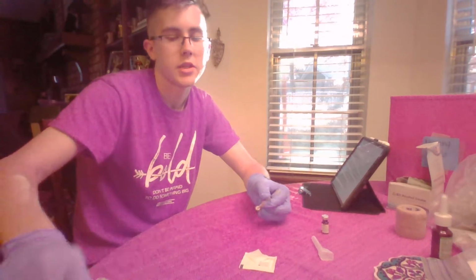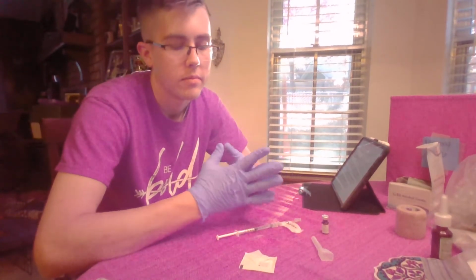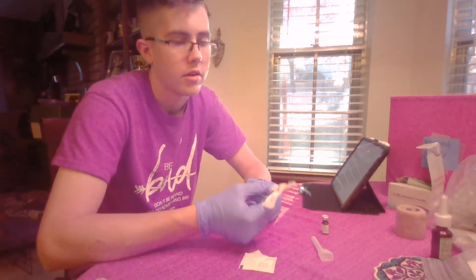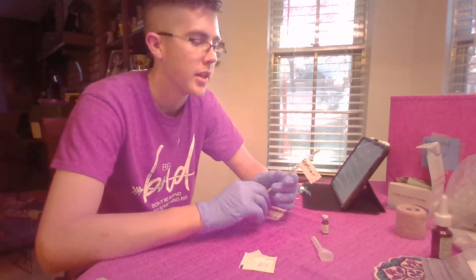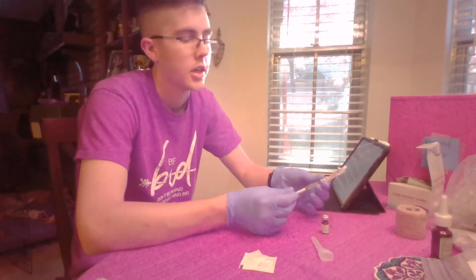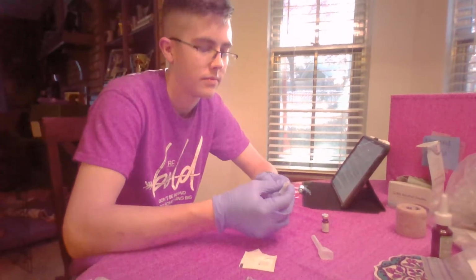Take this, place it in the sharps container, put on my atomizer, and then I will cease any form of ventilation. I will go over and inspect my patient's nostrils to see which one is larger, is least obstructed. Once I find that, I will then take my atomizer, go stick it inside the nostril, administer the medication briskly, then resume ventilation and evaluate for any non-desired side effects.